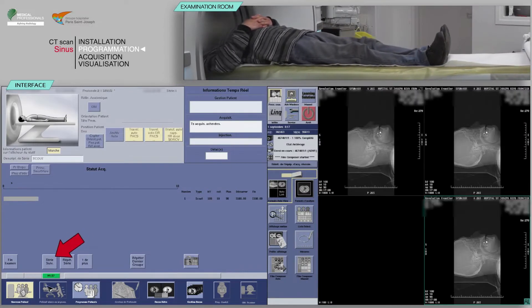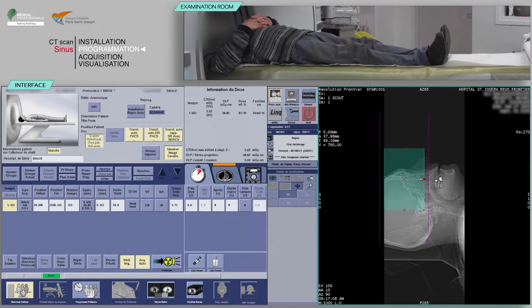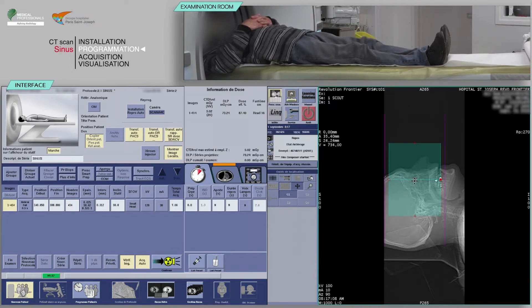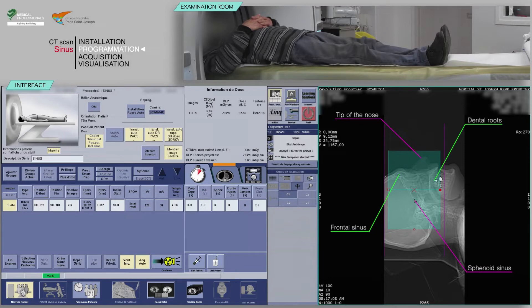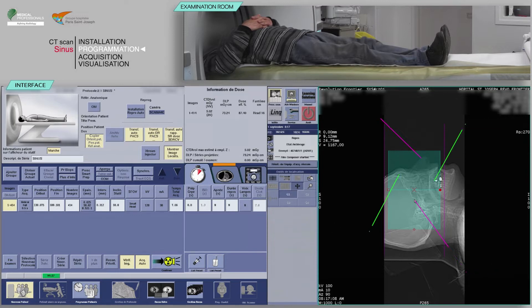Click on Next Series. Place the slices box on the frontal or AP localizer in such a way as to cover from the frontal sinus superiorly to the dental roots of the maxilla inferiorly. Then check the lateral localizer to make sure you cover the sphenoid sinus posteriorly and the tip of the nose anteriorly.